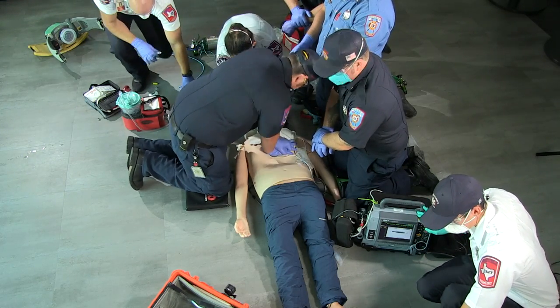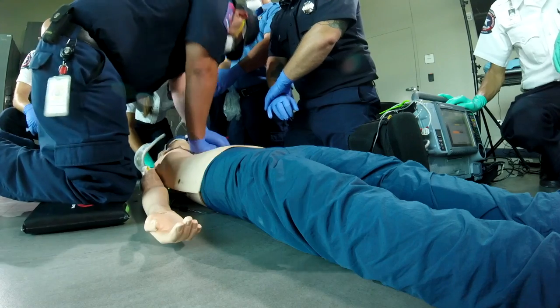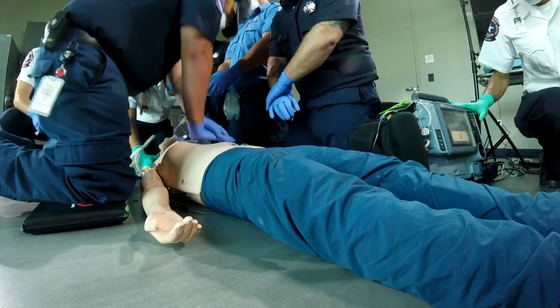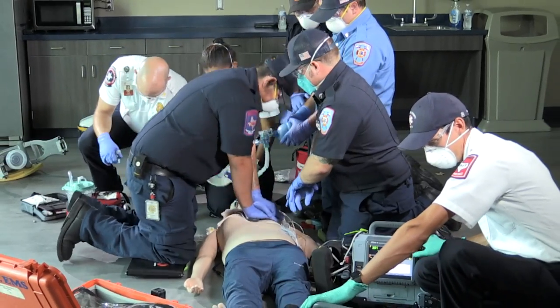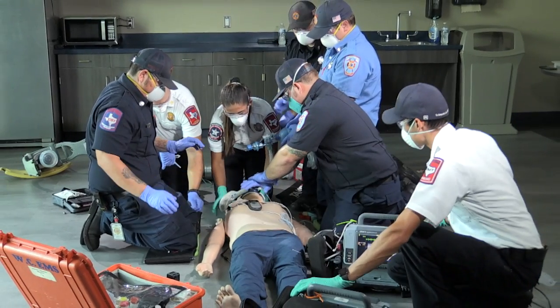Charging. Counting up — 1 through 10. Alright, hold. We're still in V-Fib. Shocky 1, shocky 2. Start CPR.